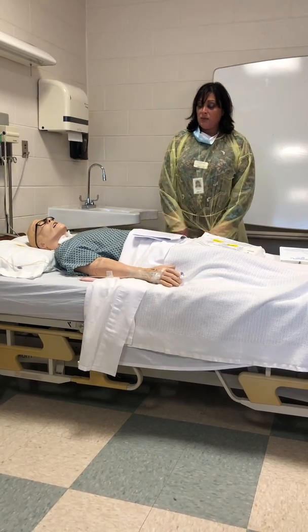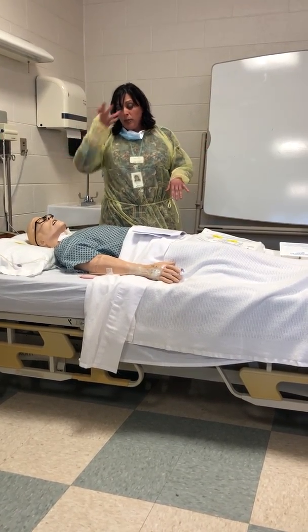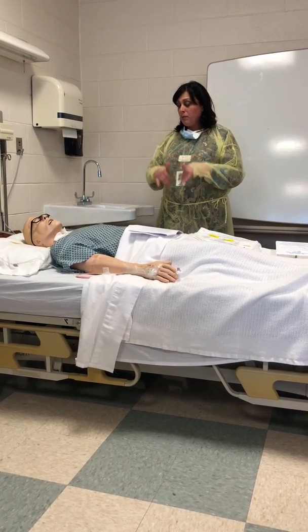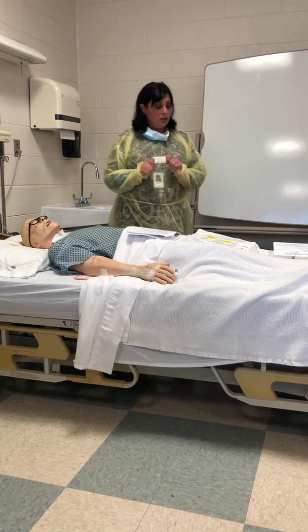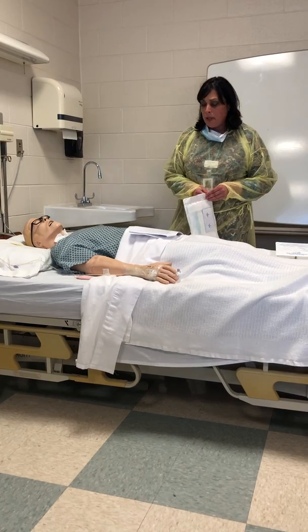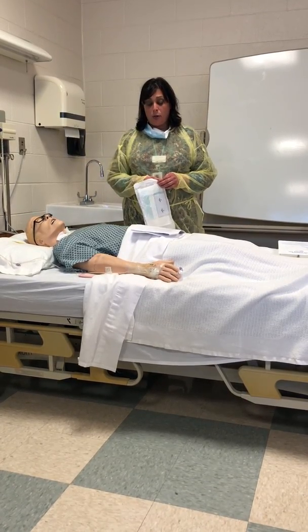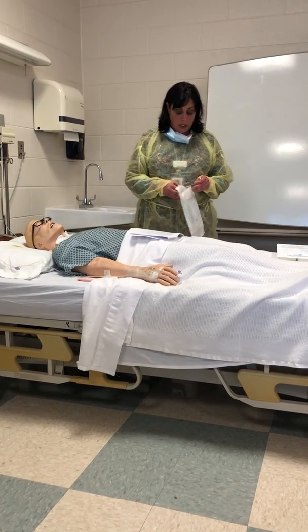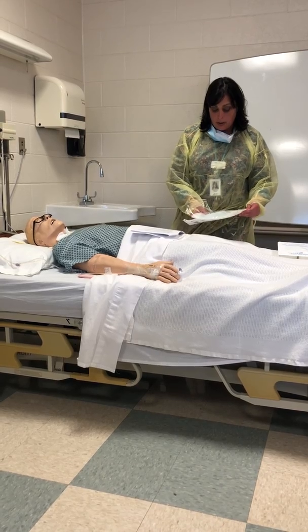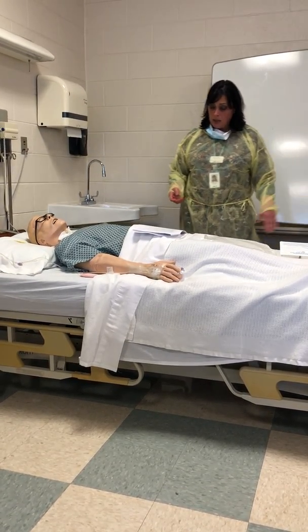Okay, so we did our assessment. You don't just respiratory suction at random, because respiratory suctioning can damage the airway, even though it's a soft, flexible catheter, and we're entering into the airway, and potentially that can increase the risk for an infection as well. So we don't just do it willy-nilly, we only do it whenever there's a cause for concern.